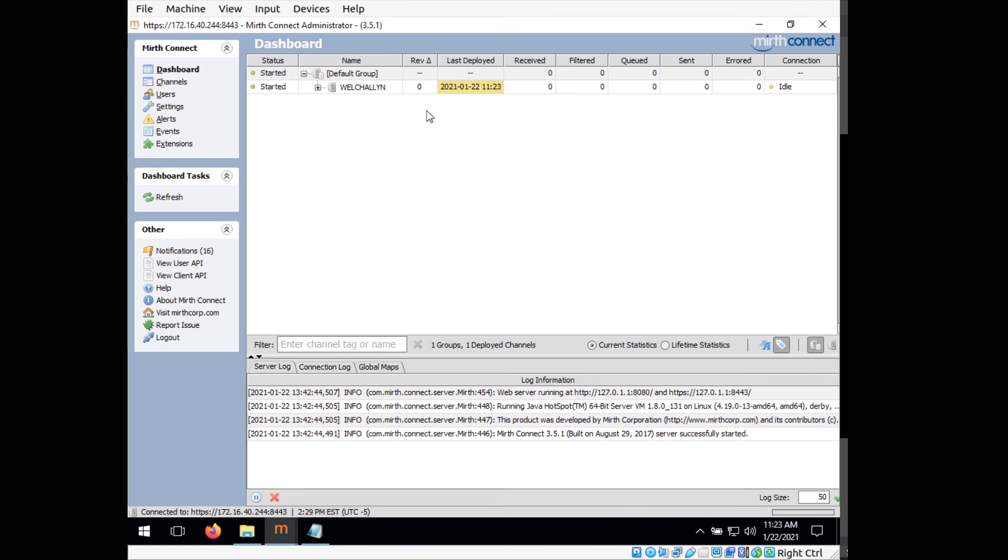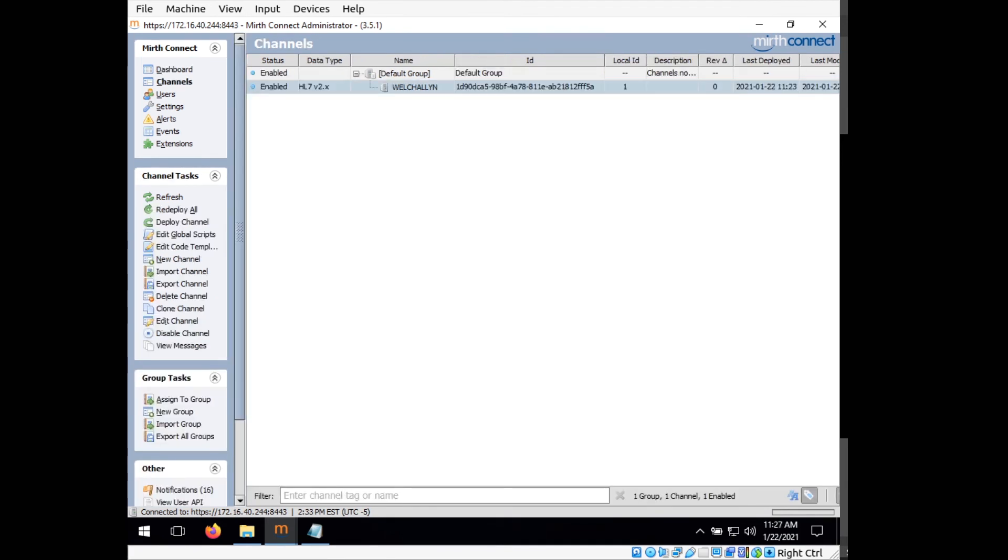So now our connector is running. So our Welch Allyn should now be able to talk to the server and send HL7 to it, which will then send it to a database. So now it's running. But before we test it with the actual Welch Allyn, we can test it to make sure it actually is working.